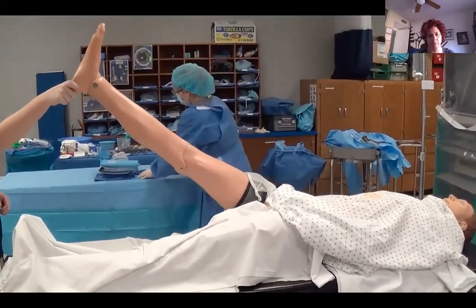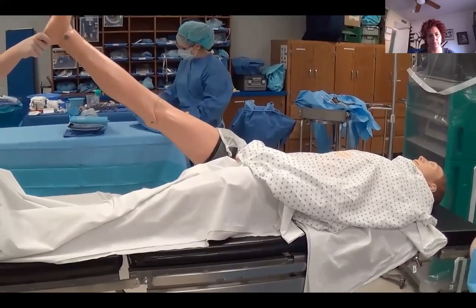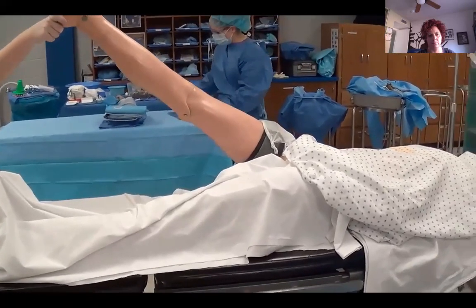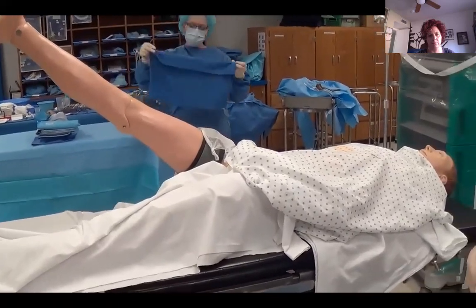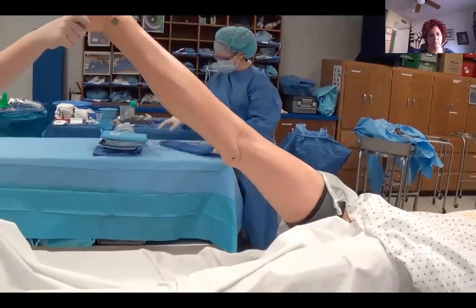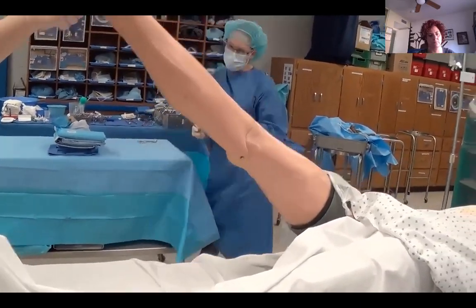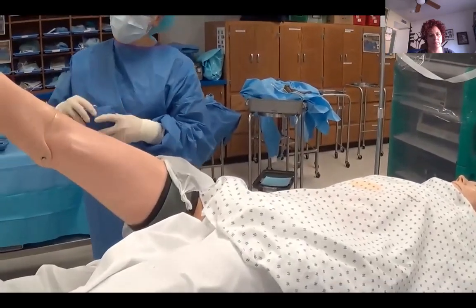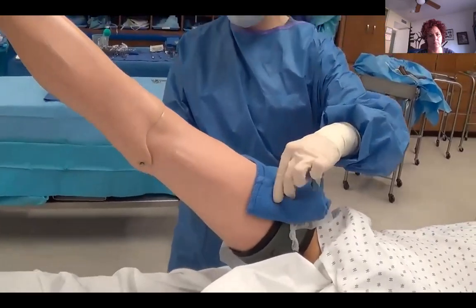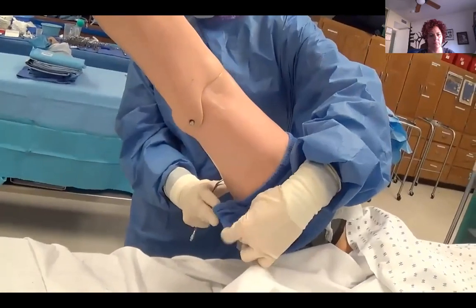So some surgeons may use what we call a roller towel, which is something that we more commonly would utilize on an upper extremity, but I'm just going to show you how we put it on a lower extremity. So it's a towel that's opened all the way, then we fold it in thirds on your back table. You're going to roll it and then we will unroll it around the extremity as we apply it. So you have to be very, very careful when you're putting this on because there's lots of risk of contaminating yourself. So make sure that you stay on the outside of the towel as this is applied.